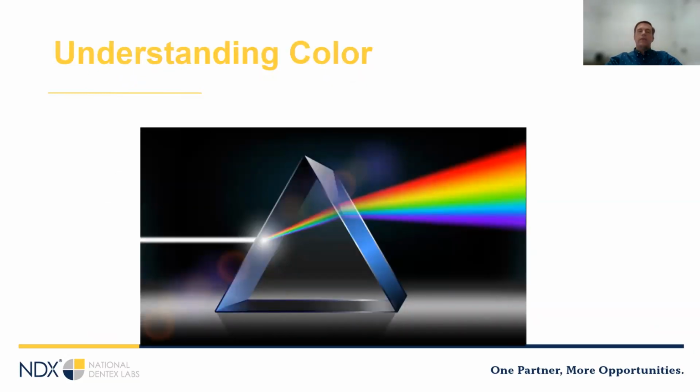Now, for a lot of these cases, the patient's just going to pick the shade and that'll be that. But if we are taking a shade, if we are trying to match a natural shade, the photos are critical. First, we need to take a photo when the teeth are hydrated, which is before we do any treatment. This is important and often different from current shade taking practices. Second, we must be sure that we have light of adequate spectrum and intensity.